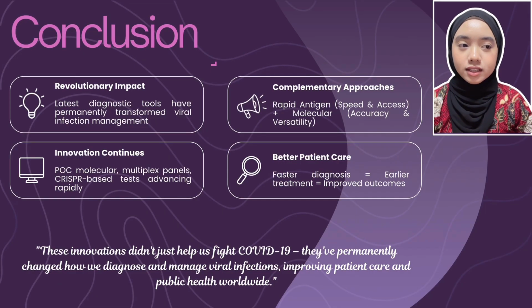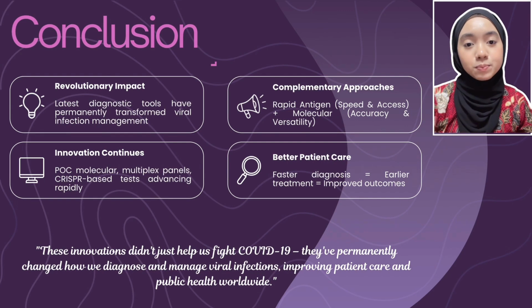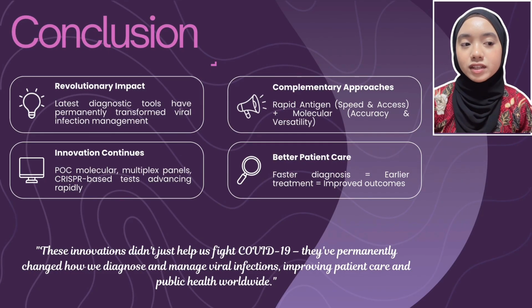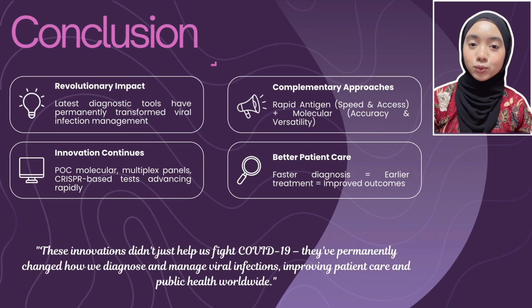So to conclude, these tools revolutionize viral diagnostics. Rapid antigen provides speed and access. Molecular provides accuracy. So point of care molecular offers both. Innovation continues with multiplex panels and CRISPR-based tests. This innovation will permanently change how we diagnose and manage viral infections worldwide.